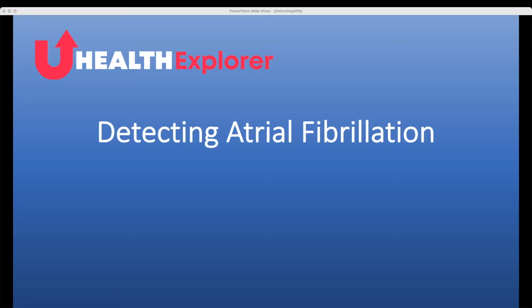Hi, this is John from UProve, and I'm here to show you how to use the Health Explorer to determine if you may be experiencing atrial fibrillation or a similar irregular heartbeat.